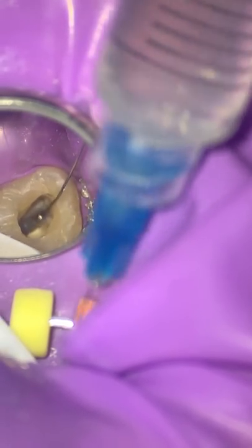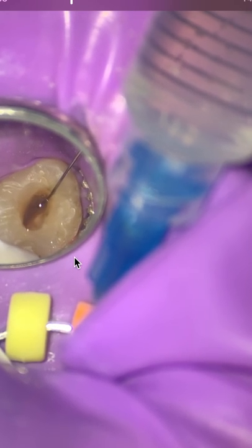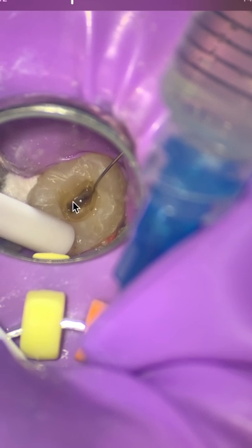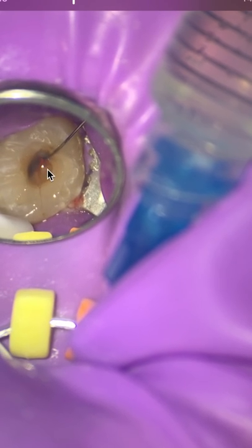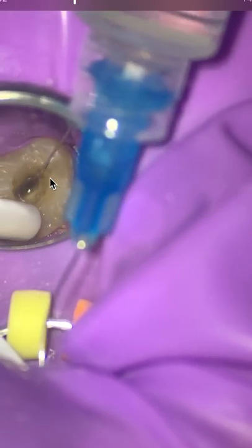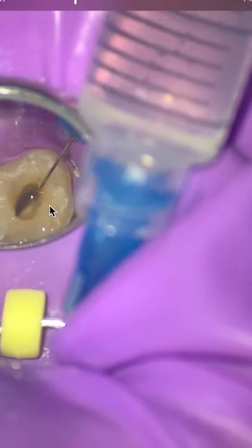And I just showed her, look, if you get rid of all the pulpal tissue, just like I did here, 99% of the time you're good to go. But in this case, look at that, that little bleed out of the buccal canal. I know now that if I can't get that stopped in the next 5 minutes, it's just not going to stop. So there's a couple of techniques.